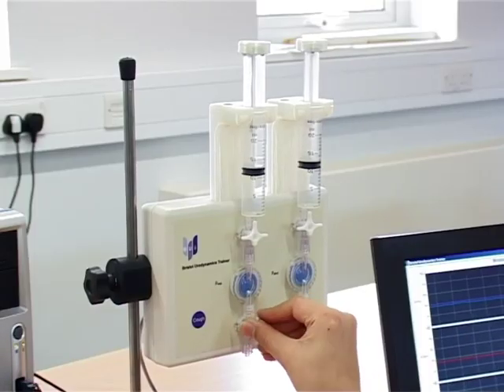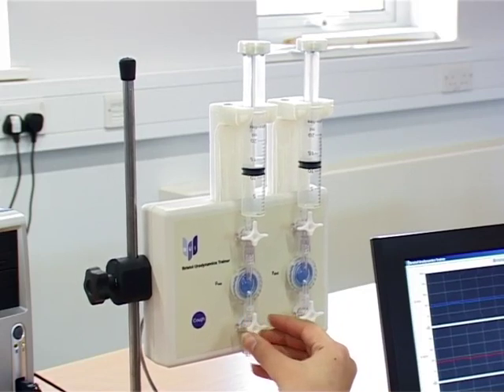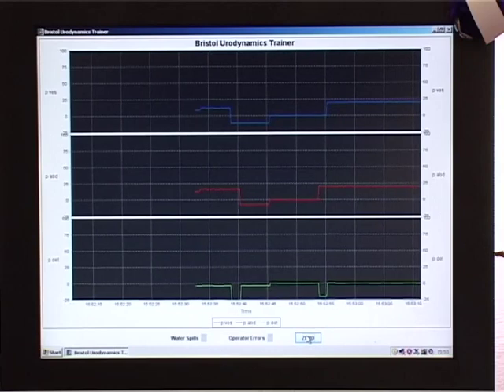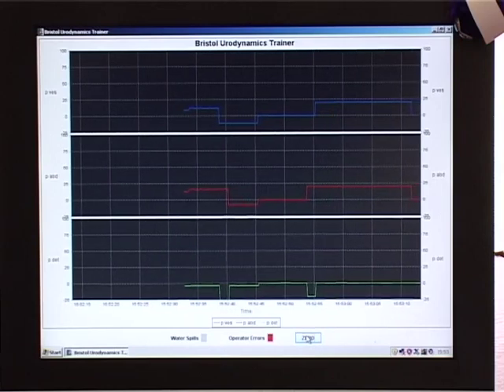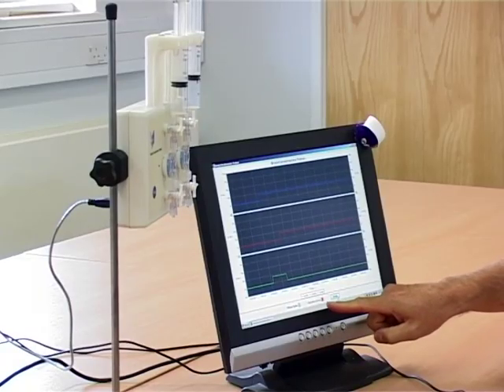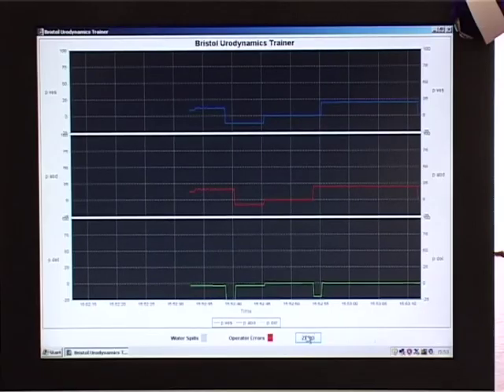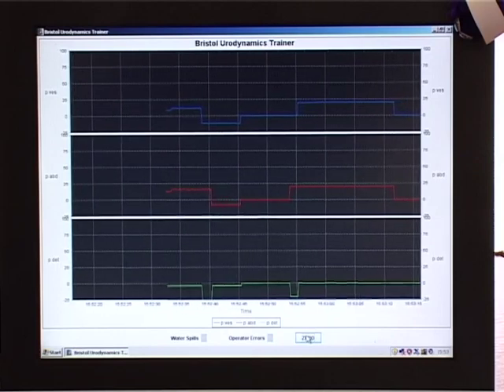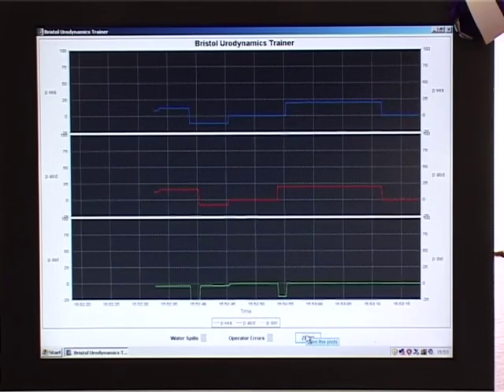If, however, zero is set while the taps are open to the patient, it would be an error as you would be setting your reference point as the unknown bladder pressure, known as zeroing to the bladder. The error signal on the screen points out that zero is being set to the wrong reference.